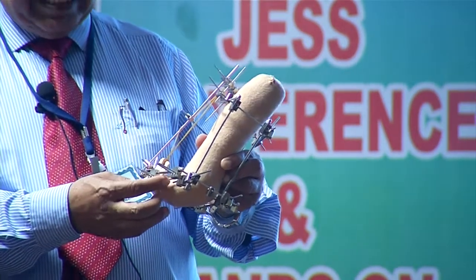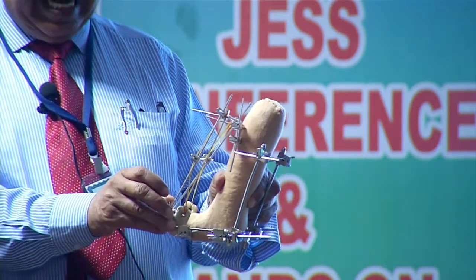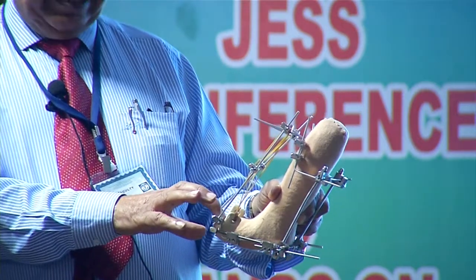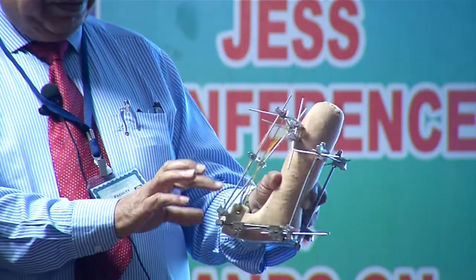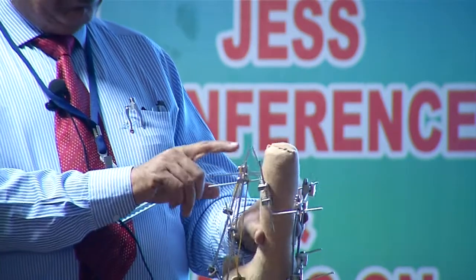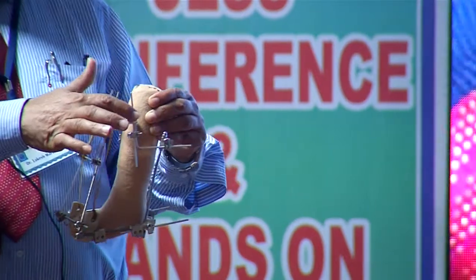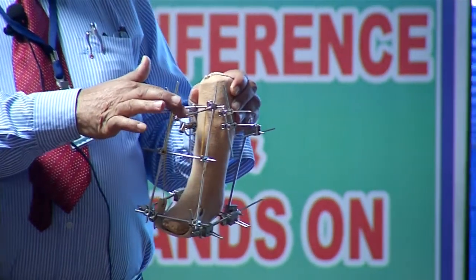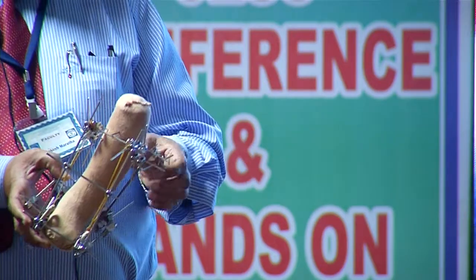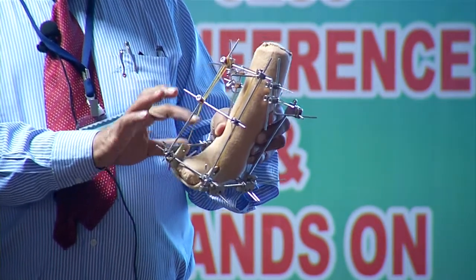On the calcaneum, one rod on the medial side and one on the lateral side. This metatarsal hold should also be made with a straight connecting rod, but it is better to use the L-rod to connect the anterior tibia-metatarsal connection. Two L-rods here — one medially, one laterally. In total, there are six L-rods, plus straight connecting rods for the other connections.